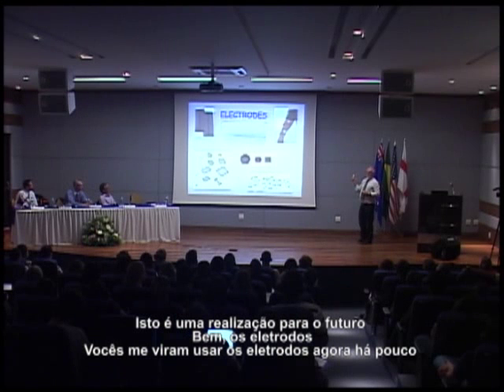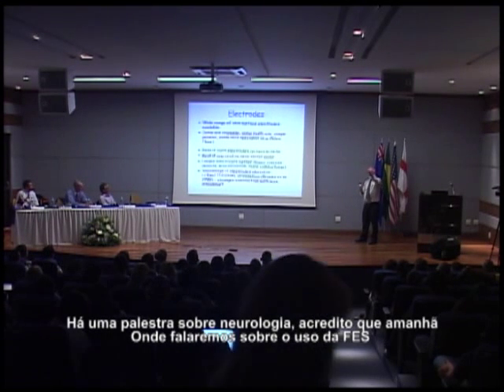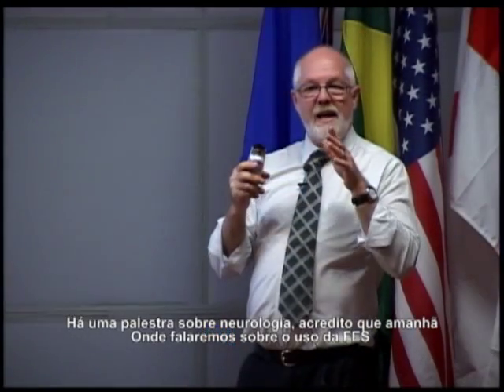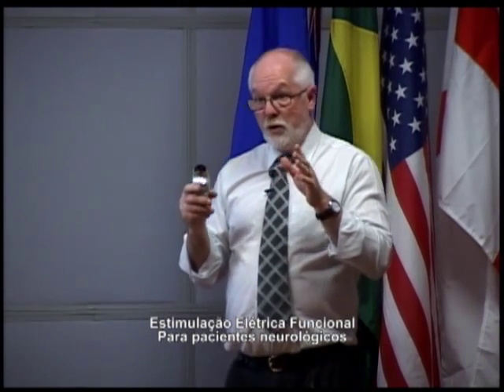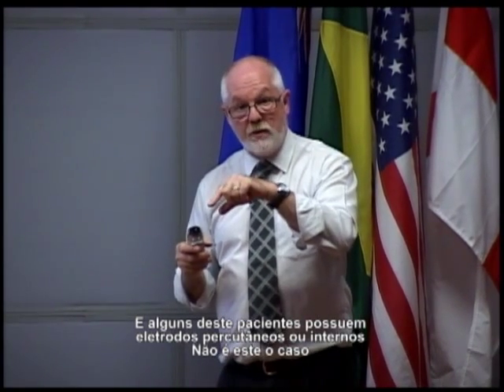The electrodes, well, you saw me use some electrodes just now. Generally speaking, we're using skin electrodes. We're not using implanted electrodes. There's some talk on neurology, I think it's tomorrow, where we're talking about using FES, functional electrical stimulation, for neurology patients, and some of those patients have percutaneous or internal electrodes.